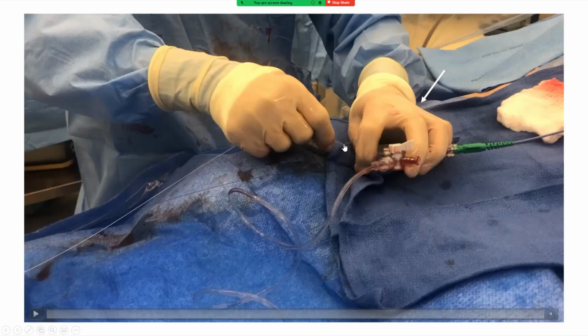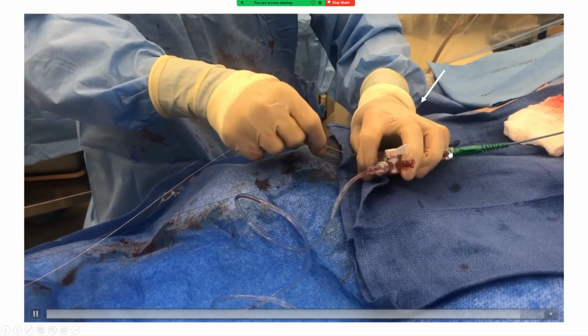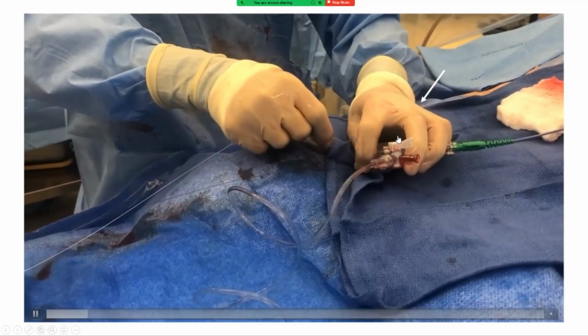So what we do in those cases, as I'm pulling the stent out with my right hand, my left hand is holding onto the wire, and the palm of it is keeping a pull tension on the guide. That's an important technique, the palm of the left hand technique. As I'm pulling my stent, the palm of the left hand is keeping a pull tension on the guide, and the fingers are not just holding the wire, they are pulling on the wire. So much so that as you're taking the stent out, you're preventing the guide from diving and the wire from diving in. This is how we do it. I'm pulling on the stent, but that palm is pulling on the guide and pulling a little on the wire. Under fluoro, you make sure the guide and the wire are not diving in. So again, the palm is pulling back on the guide.